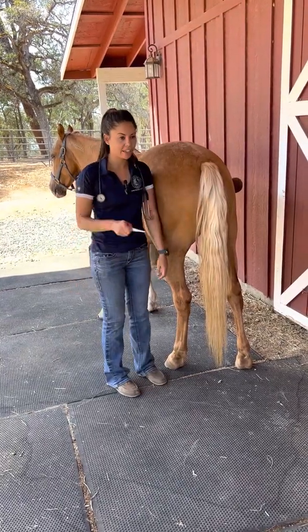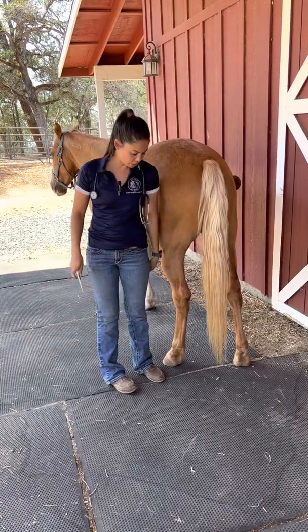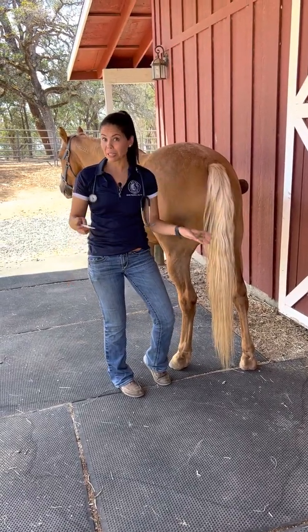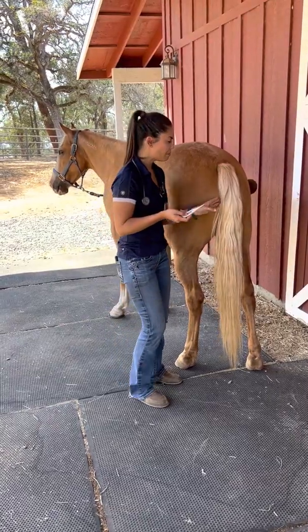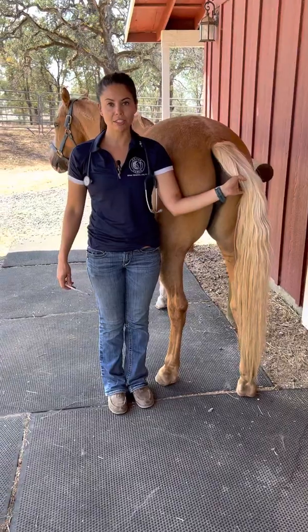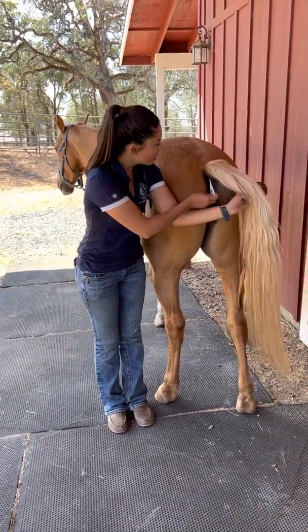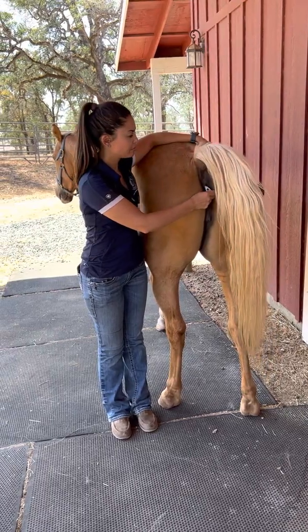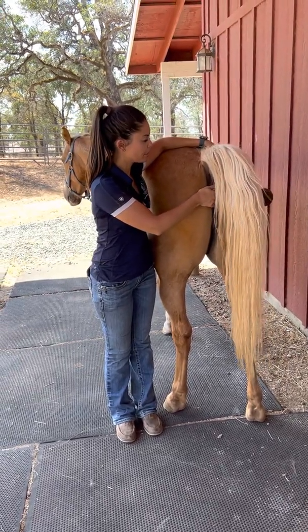So I want to stand facing her back, because this way, if she kicks me, she's going to kick my knee, and it's going to go in the correct direction. I'm not going to break my knee. It's still going to hurt, but it's a little bit safer. So I'm going to stand to her side, not directly behind her, so she can't kick me in the chest. And then simply insert your thermometer and wait for your temperature to come back.